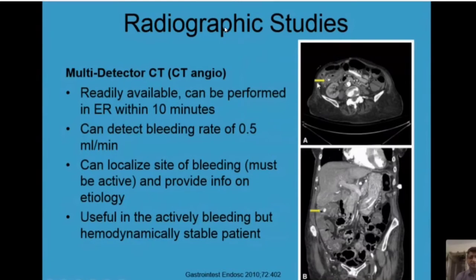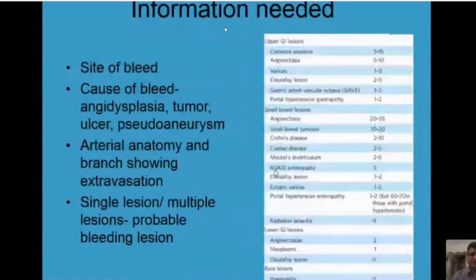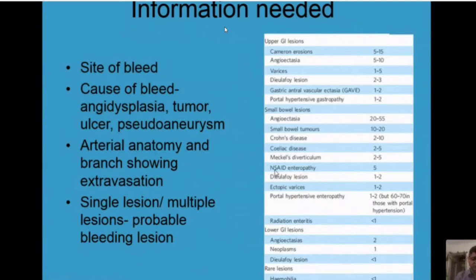That's a CT angiogram demonstrating an area in the hepatic flexure of active extravasation of contrast. Why is CT scan important? It will give us a lot of information — the site of bleed, the cause of bleed. On an angiogram I may see a bleed but not know if it's angiodysplasia, a tumor, an ulcer, or a pseudoaneurysm. CT will give me the arterial anatomy and show me the branch causing the extravasation. More than that, it will also tell me in cases of angiodysplasia whether it's a single lesion or multiple lesions. When there are multiple lesions, we do not treat all of them — we treat only the lesion which is actively bleeding.